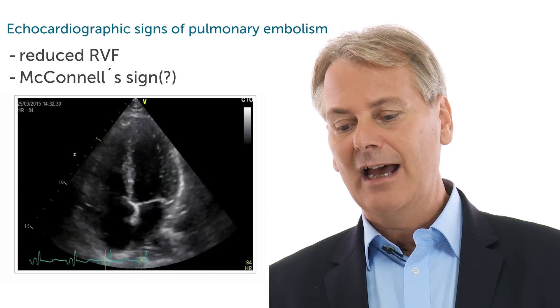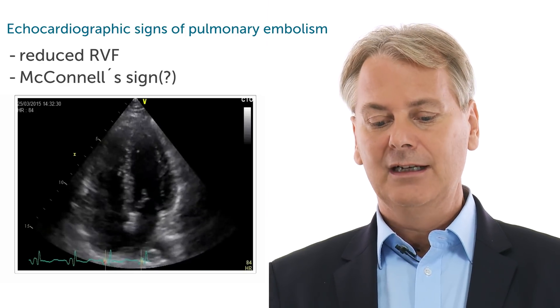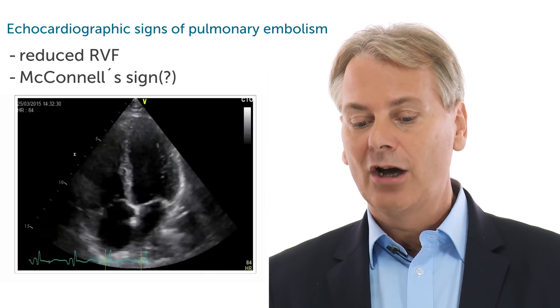Both of these are findings you can see in pulmonary embolism. And there's another finding — if you look at right ventricular function, right ventricular function is also reduced.